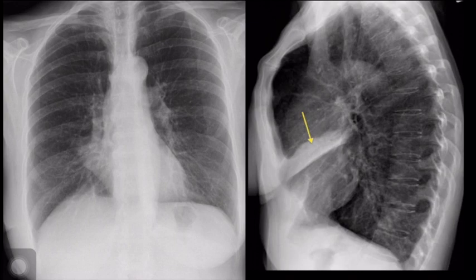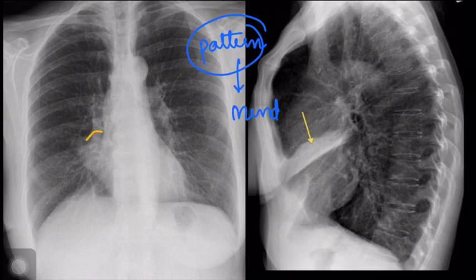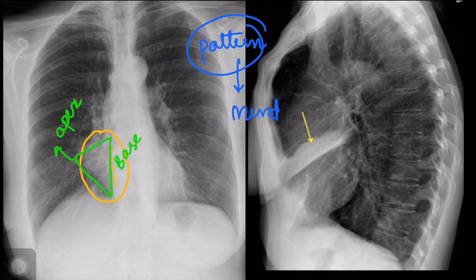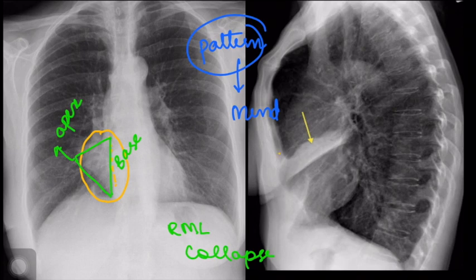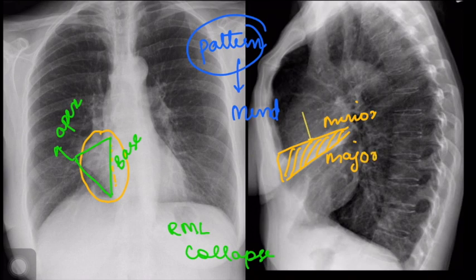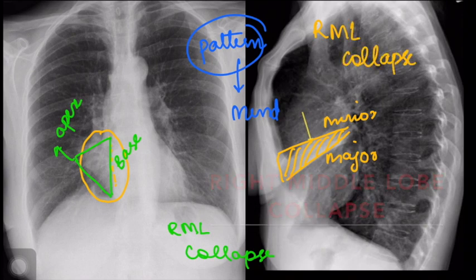In summary, once you spot an abnormality on a chest radiograph, stamp the pattern in your mind. On the frontal radiograph, an opacity with loss of the right heart border silhouette, with a triangular or wedge-shaped appearance with apex pointing away and base towards the heart, is the imaging appearance of right middle lobe collapse. On the lateral radiograph, it appears as a wedge-shaped opacity overlying the cardiac shadow due to displacement of the minor and major fissures. Keep this image in mind to diagnose right middle lobe collapse in the future.